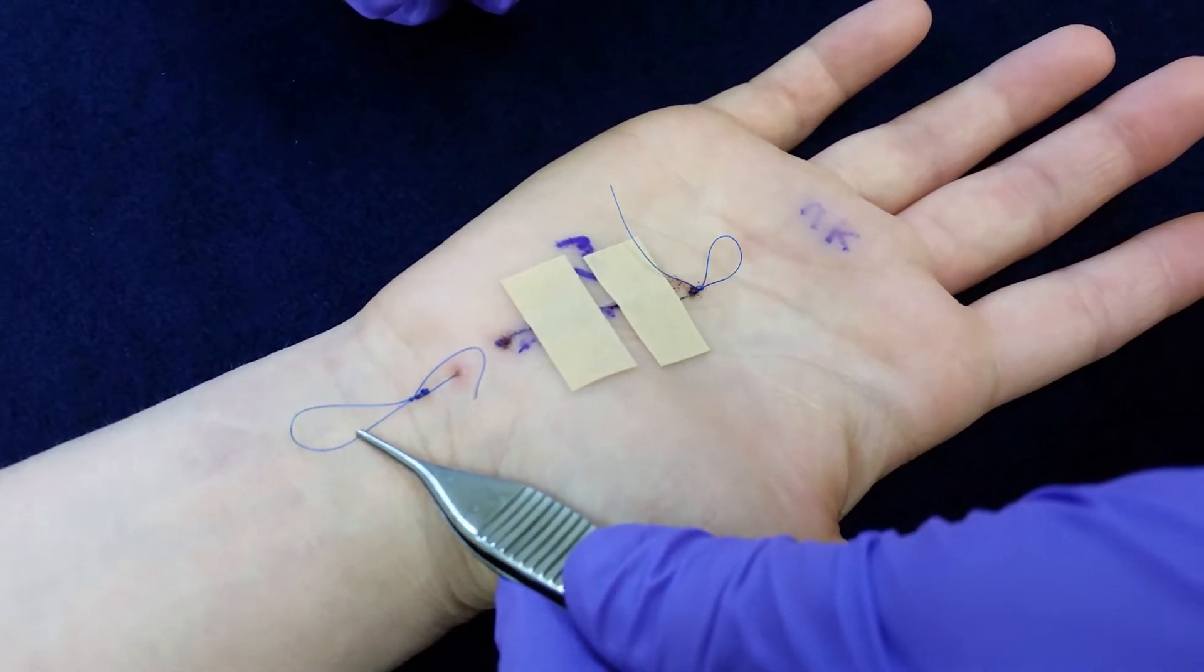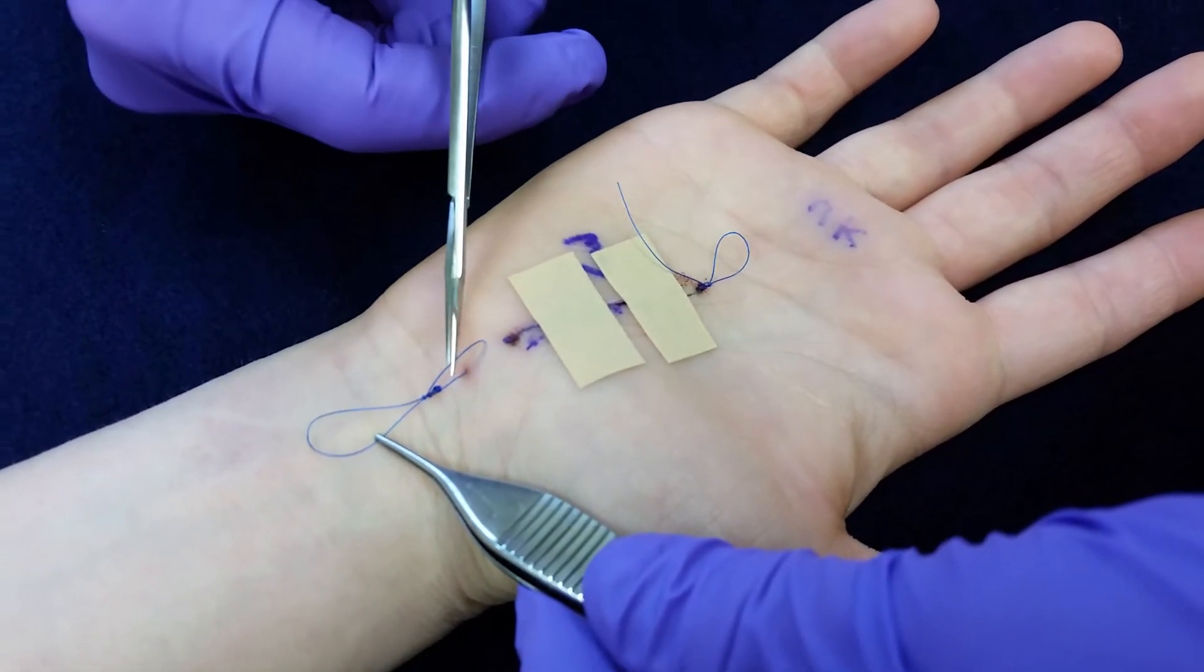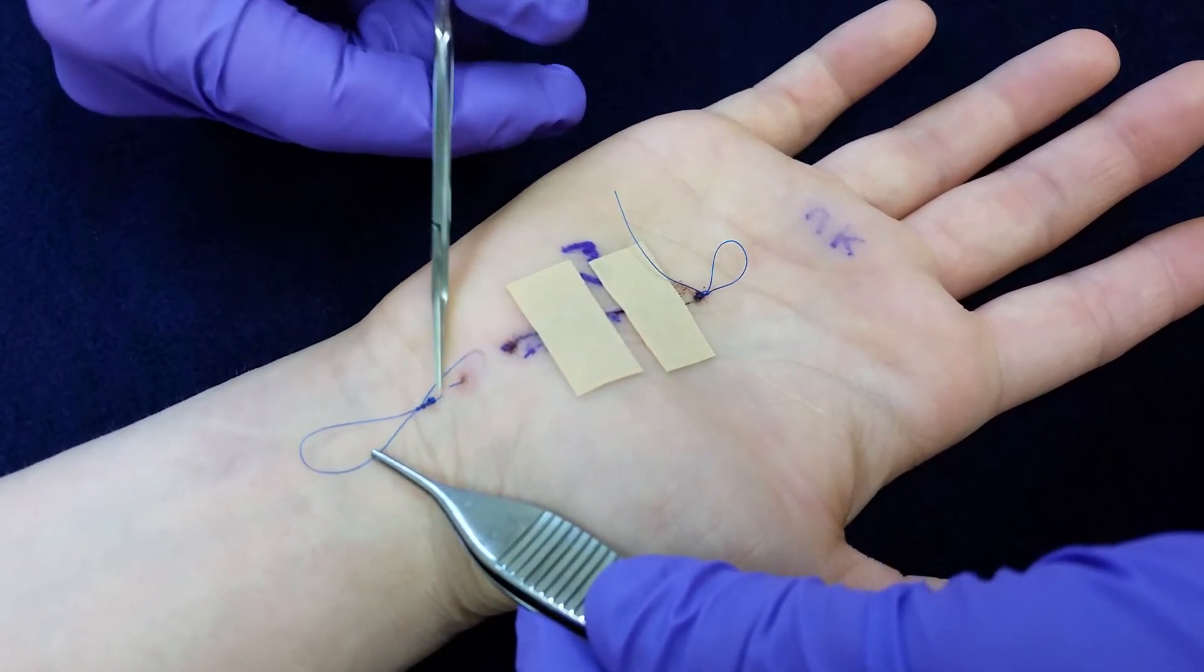And what you can see there is beneath the knot you can see a little string, and we're going to go ahead and snip that string. Perfect.